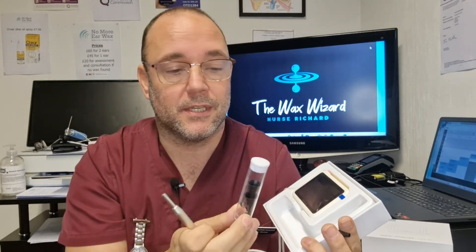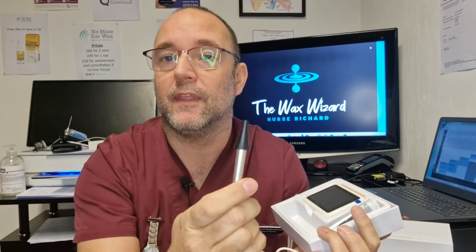Another thing that sets this apart is it comes with this specular. Now what's a specular, I hear you ask. You put that tip on the end of the camera, and when you put it in your ear it stops you over-inserting it, so it's not painful or uncomfortable. It's really good for children, as children don't always keep still when you're trying to check their ears out — so that's really good for safety.